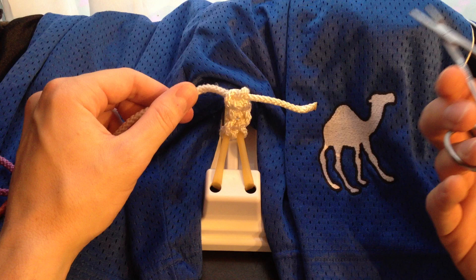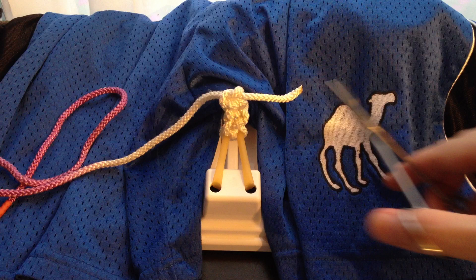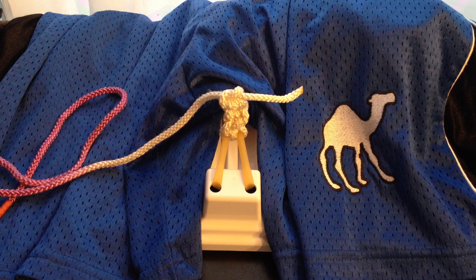And that's it — that is the instrument tie for right handers. The benefits of this is that it's quick, it's easy, and as you can see, you can tie a lot of knots at the very end of the suture thread. This allows you to tie many knots with the same piece of suture and save the hospital some money. Practice this knot until you get it — it's very valuable in the OR. Thanks for tuning in, and good luck.